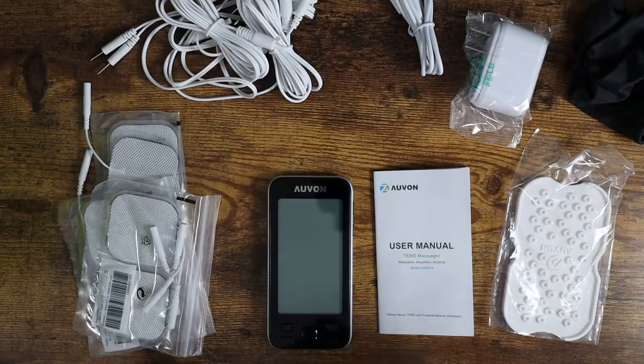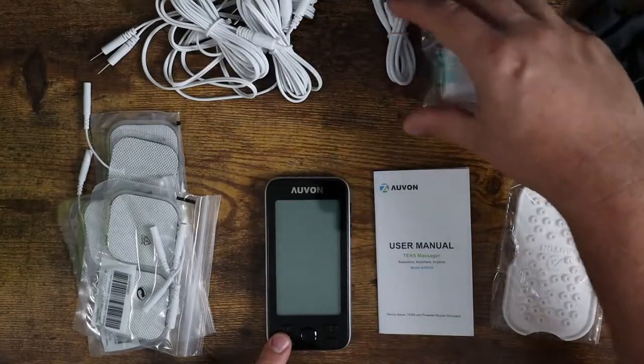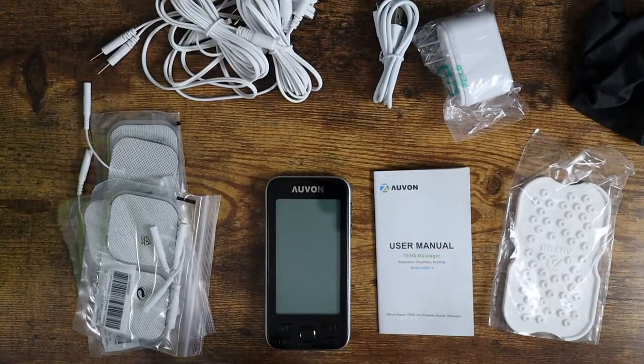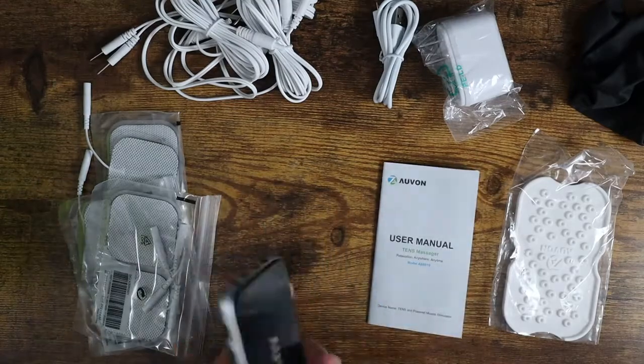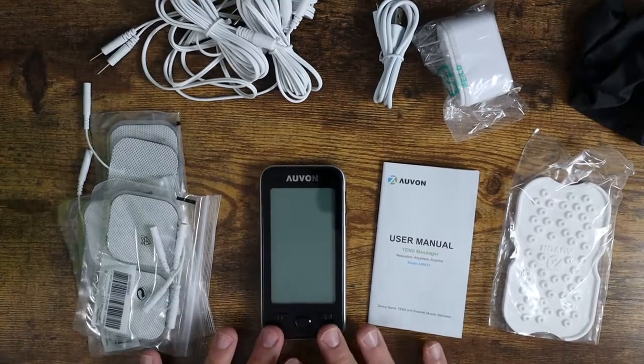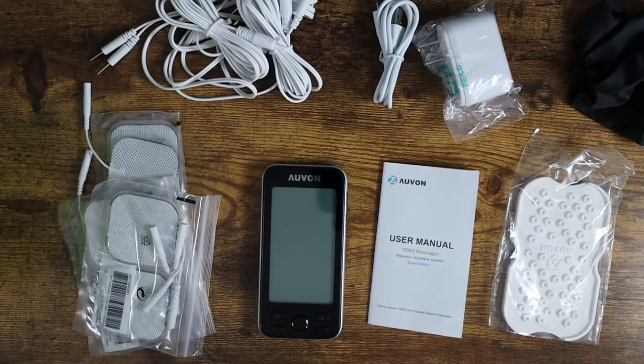Here is everything that you get in the package. You get the TENS machine itself, which is a rechargeable device. You get a charging wall plug as well as a charging cable so you can keep this guy charged. The great thing is that it's wireless, so you can charge it up and bring this anywhere. You can move it around, walk around with it on — completely wireless. You don't need to keep it plugged in to work, which is great.